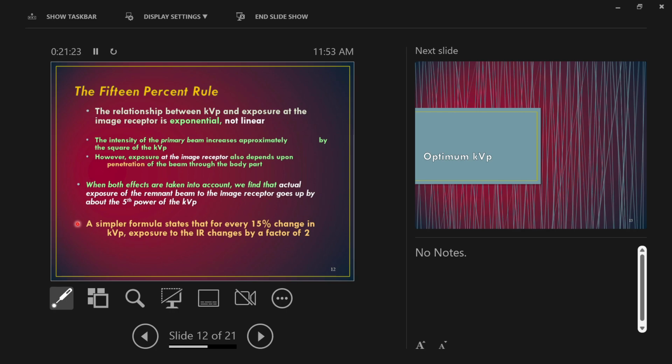We'll use it. 10 mAs. Let's say the hand was 4 centimeters thick. You get this number, patient number 1. Patient number 2 comes in. We want to do a PA hand, but now patient number 2 is 8 centimeters thick.